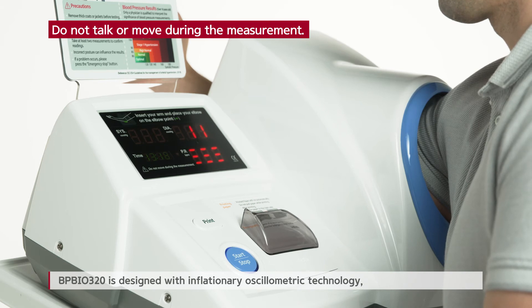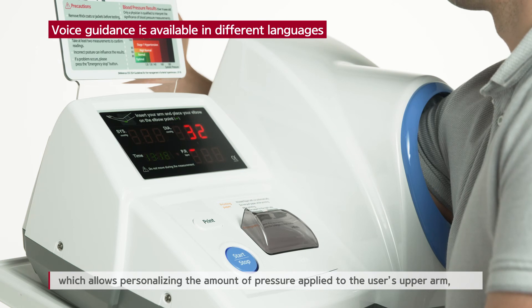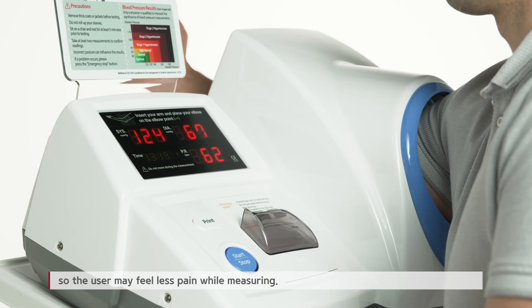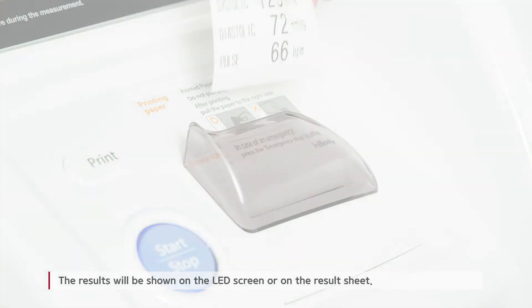BPBio320 is designed with inflationary oscillometry technology, which allows personalizing the amount of pressure applied to the user's upper arm, so the user may feel less pain while measuring. The results will be shown on the LED screen or on the result sheet.